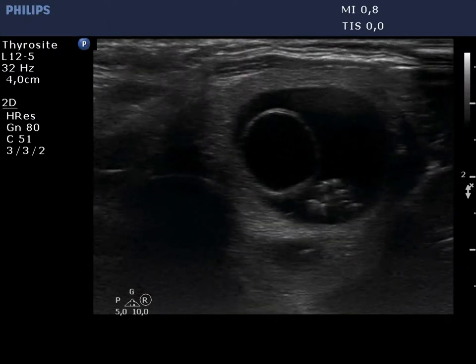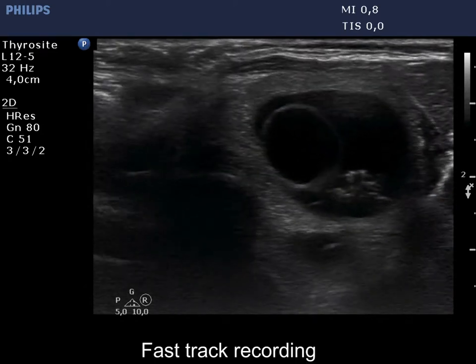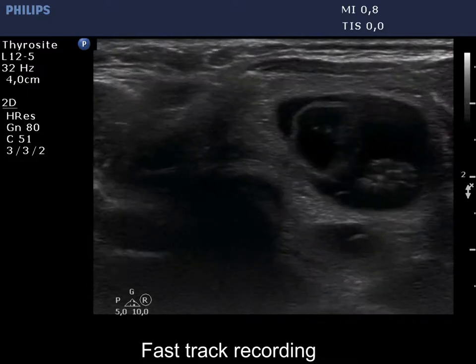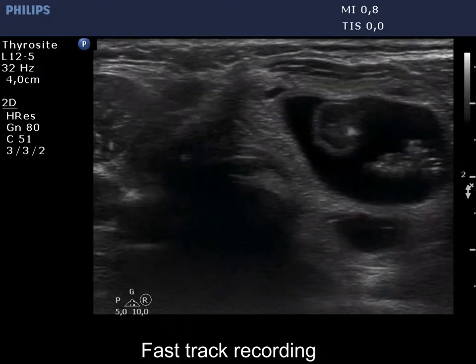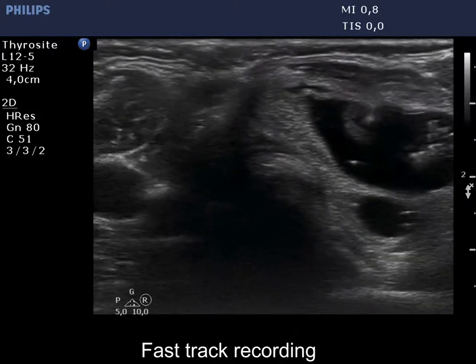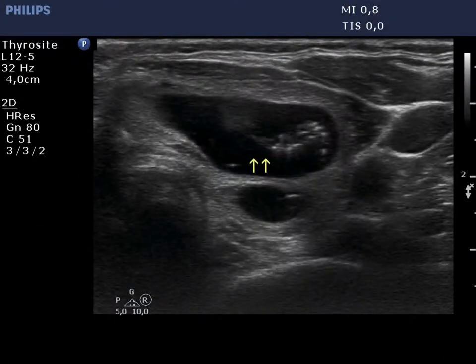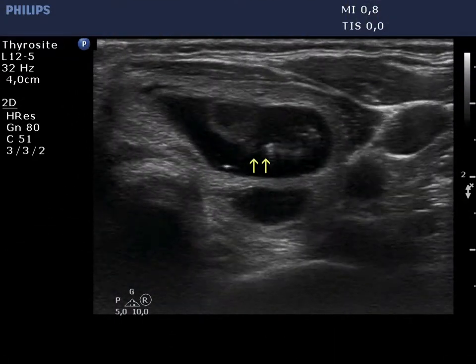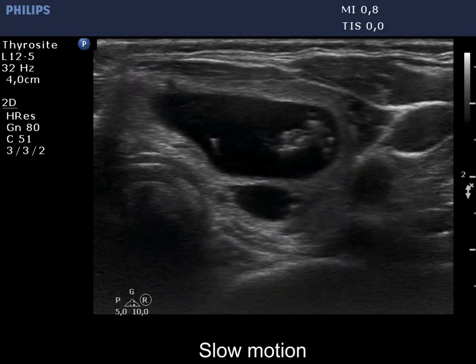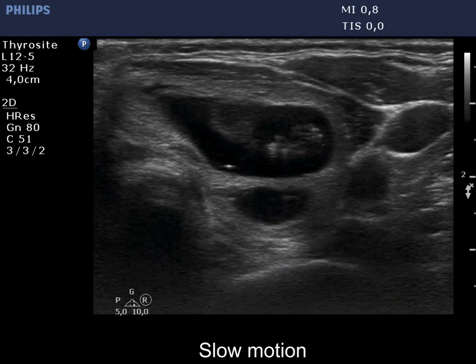Now we locate the lesion in the center of the field of vision and start with the aspiration. The moving structure marked with yellow arrows proves that the lesion has started refilling at once. It is worth analyzing the video before we start with the second phase of aspiration.